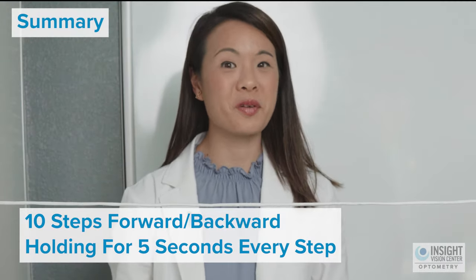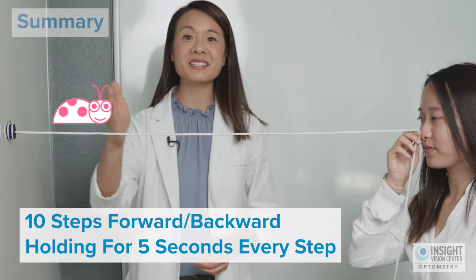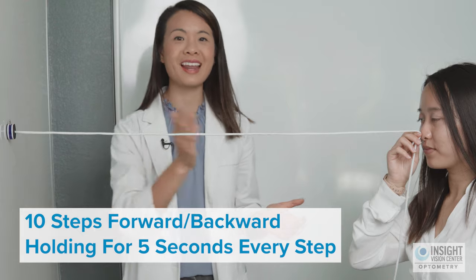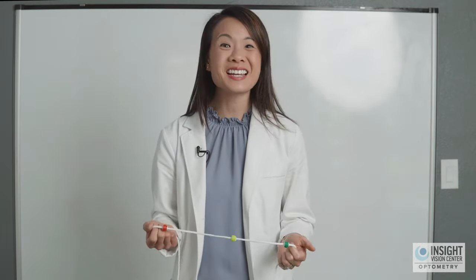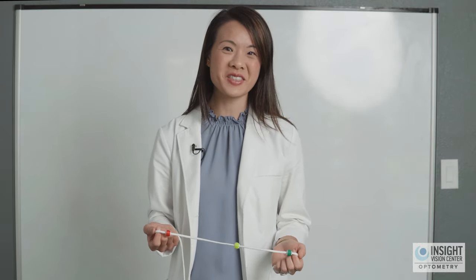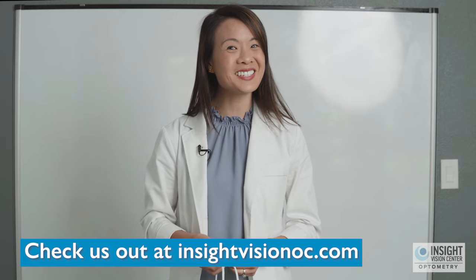To summarize level three of the Brock string: imagine an imaginary bug, take ten steps forward on the string using your eyes alone, holding for five seconds at every point, then do ten steps back. Thanks for joining us to learn the Brock string exercise. If you want to learn more about vision therapy, check out our website at insightvisionoc.com. I look forward to seeing you soon.